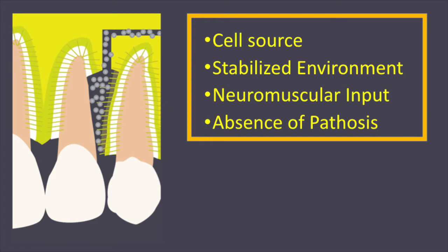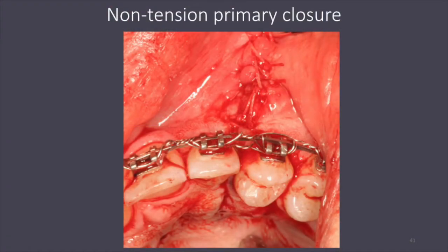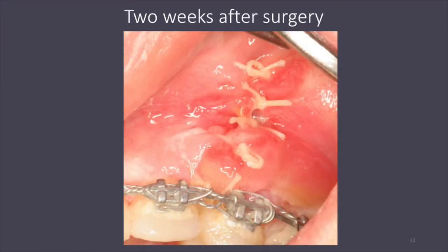Now, when this segment is protracted forward, it carries also the soft tissue. The soft tissue is transported forward with the segment, which allows for a non-tension closure of the chamber with soft tissue. So there is an advantage in limiting the potential for infection, and so there is an absence of pathosis. So this chamber should have a high probability of healing.